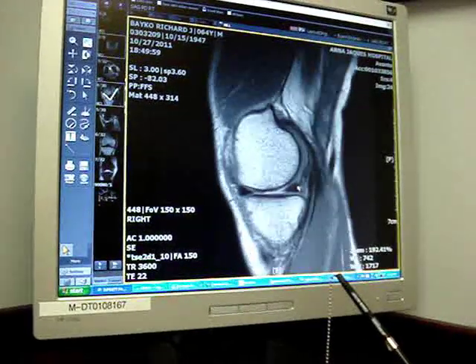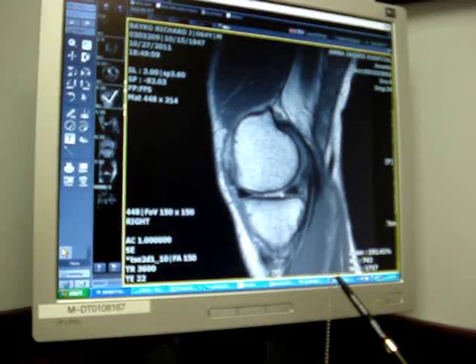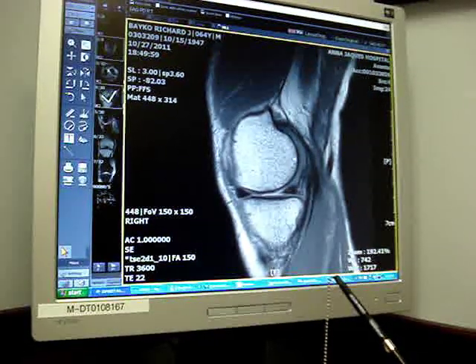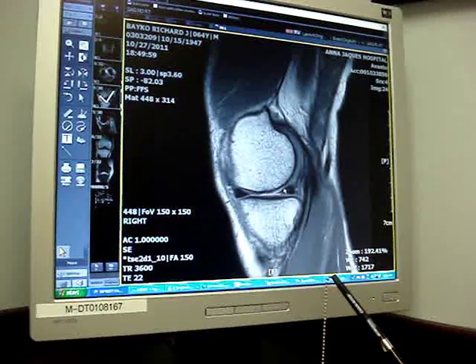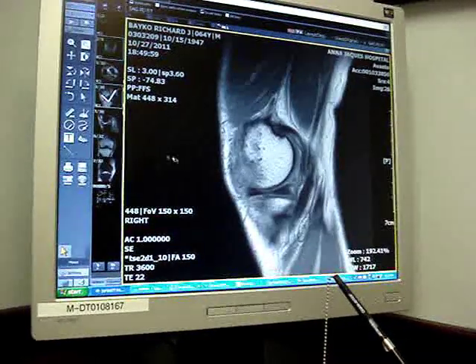So there's definitely a tear of that medial meniscus. The articular surface could be a little rough — the bone joint surface is this area here, and it looks like it may be losing a little bit of joint surface there. So that's what that shows.